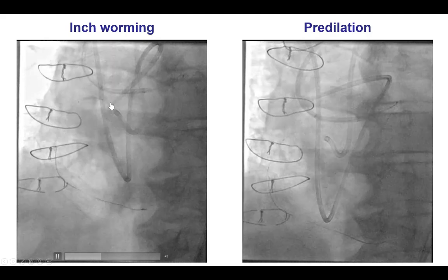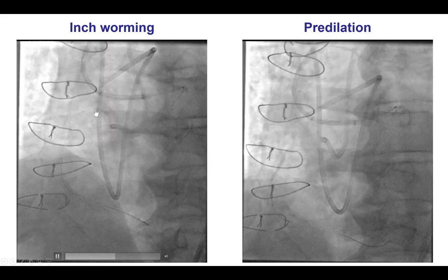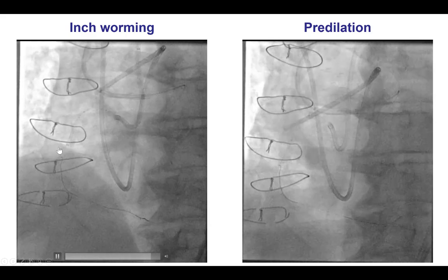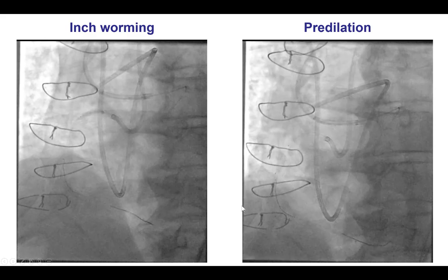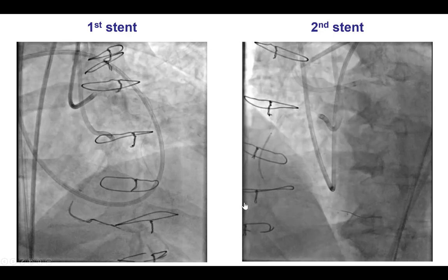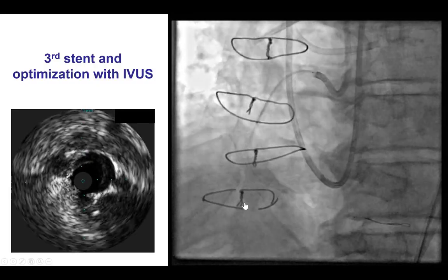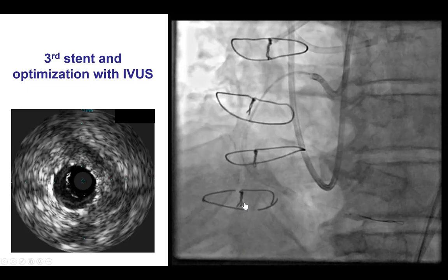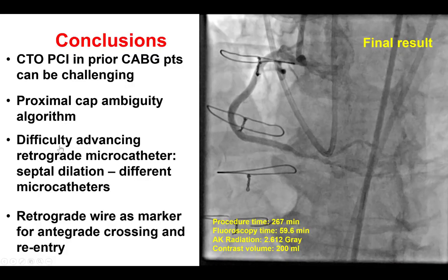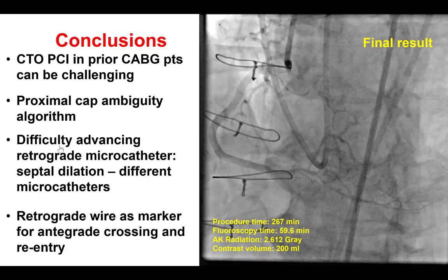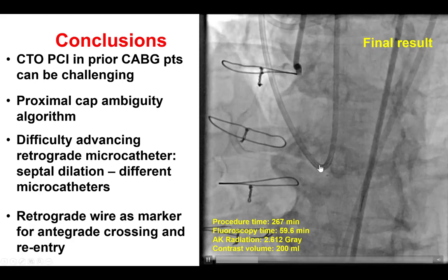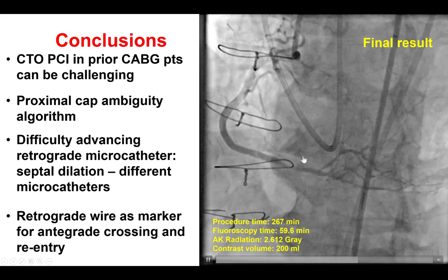We used the inch-worming technique to advance a guide catheter extension. The balloon was inflated and deflated, the guide extension advanced nicely all the way to the mid-right coronary artery. We pre-dilated the lesion, then placed stents from the distal to the proximal right coronary artery. Intravascular ultrasound was performed to ensure good stent expansion and stent strut apposition, providing a nice final angiographic result with TIMI flow into the distal vessel. The patient had resolution of his ventricular tachycardia.